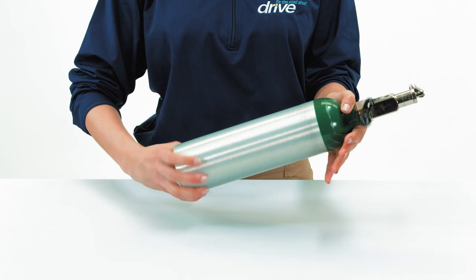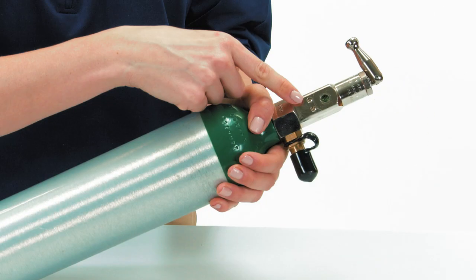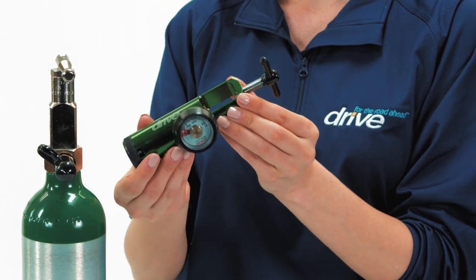Now let's go through the setup of your regulator. Inspect the cylinder per the manufacturer's instructions for damage, as well as any debris near the valve seat. Inspect the regulator for oil or grease. Do not use the regulator if visible. Inspect that the seal washer is in place and appears to be in good condition.